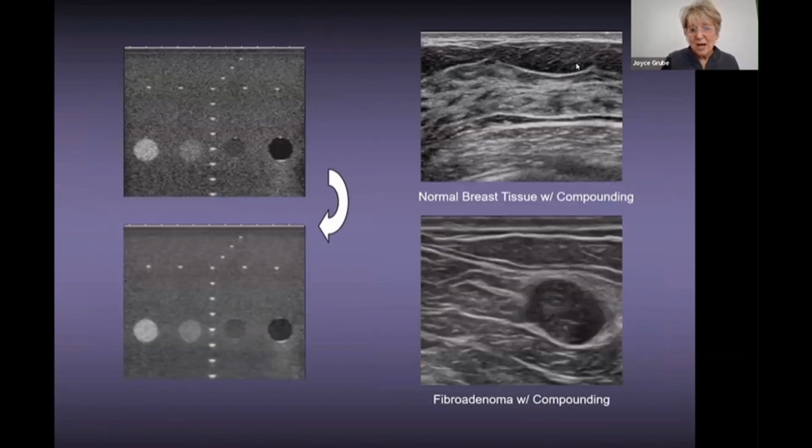And so, you know what? This is with tissue compounding on it. That's not bad. I like that picture. This one even looks, and I like smooth pictures, this one looks a little too smooth to me, though, where the tissues start to become a little wavy. That's a compounding level that's a little too high.